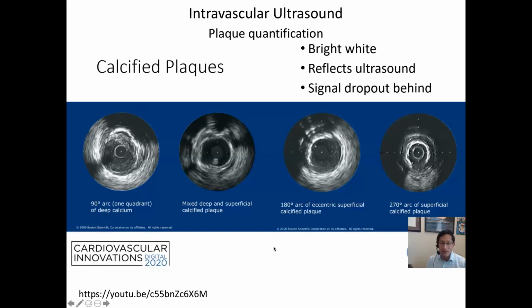So to understand what your calcium situation is, is it worth doing this? That's what you have to ask yourself. Like, if I'm going to treat this vessel, am I going to put a stent in it? Do I want to know what the calcium content is? Do I need to do this first, right? You can see calcium a little bit on coronary angiography.